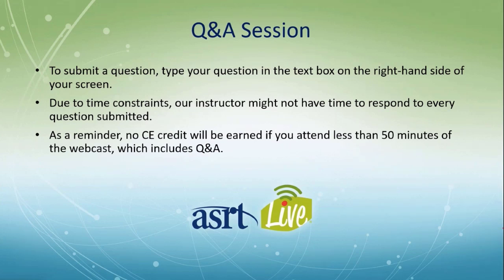If digital images can be modified post-exposure, are grids no longer necessary? That's interesting. I would encourage you to go watch my grid presentation that I mentioned on ASRT Live, where we spent a whole hour talking about that. And we have virtual grids now as well. To summarize my recommendations in there, I'm recommending three things: using grids, going non-grid on some things that we used to do with a grid that are borderline, such as shoulders and necks, using lower grid ratios, and also combining virtual grid technology. If you use the virtual grid, you may be able to get by without a grid or with a lower ratio grid.